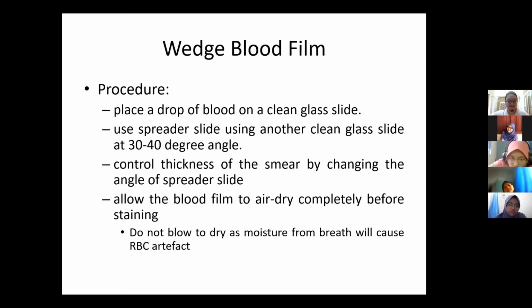You kena tarik sikit, kenakan pada blood yang dah dititikkan itu, tunggu sekejap biar darah tu meresap dan mengalir ke seluruh tepian spreader slide, and then the airplane will start to move along the landasan and take off. Sebelum landasan tu habis dia kena take off lah. Tak boleh tunggu landasan dah habis pun masih lagi tak take off, and then terbabas.